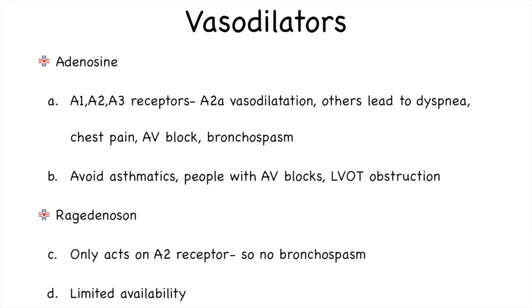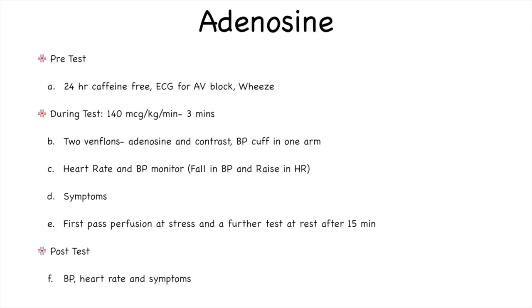However, it is not available that easily in India at this present moment. So if a patient is given an adenosine stress perfusion cardiac MR appointment, we make sure that the patient is 24-hour caffeine free prior to the procedure. The ECG is evaluated for AV block.